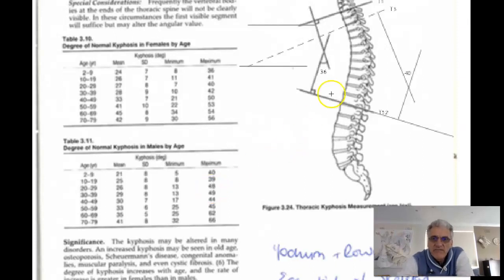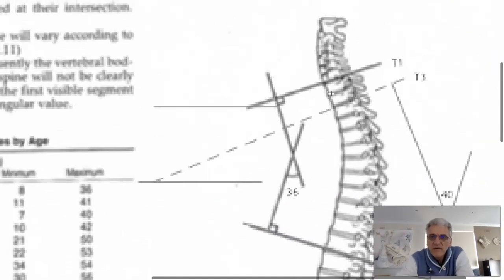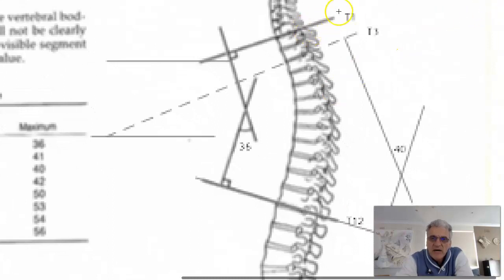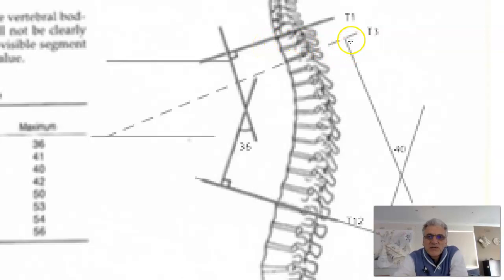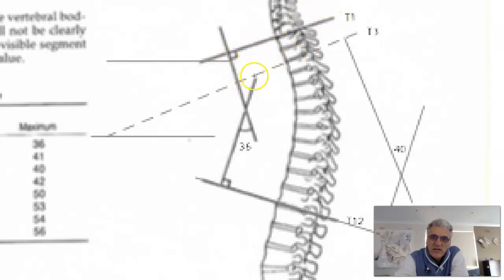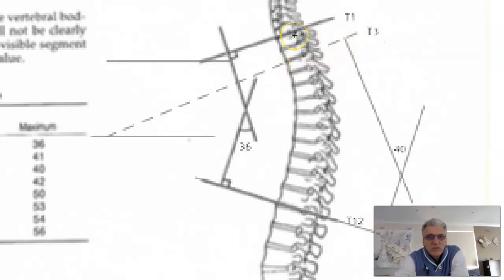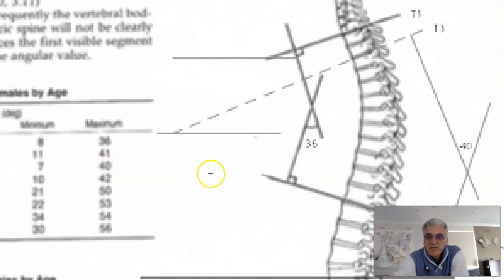Here on the X-ray I've constructed how they've done it — going from the top of T1. Sometimes you won't see T1, so you have to go down to T3. You'll see that the angle increases somewhat — that line is not as tilted as that one. So you add an extra 4 degrees to the T3 vertebra if you're measuring from T3 because you can't see T1. Add 4 degrees to all of those minimum and maximum values.